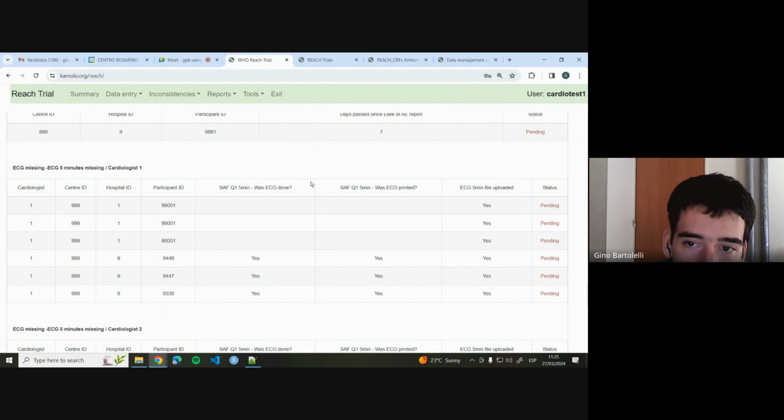So you'll need all this. That's why I'm listing everything here, so that you have everything you need to do the assessment and enter the ECG form. Okay.